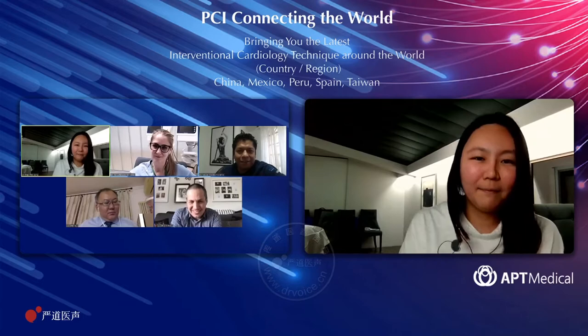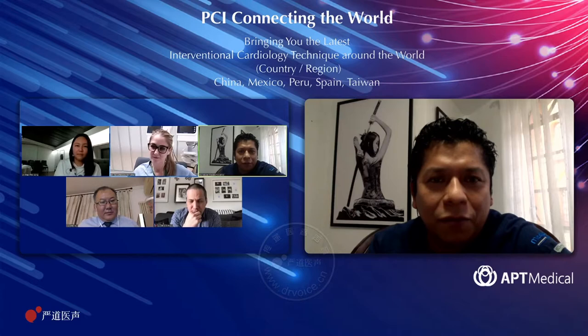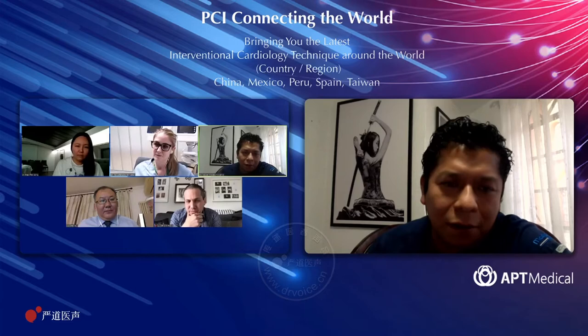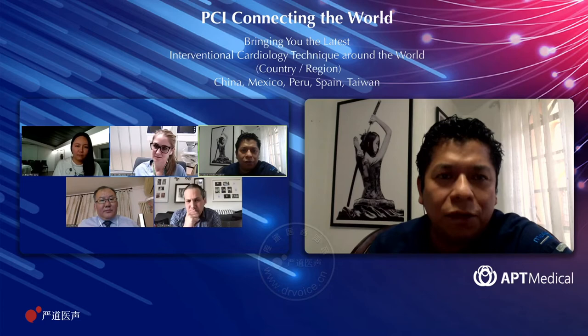Okay, any other question or comment? I think it is a great device again. We have the opportunity to use it in many situations. I think you have some experience with optimizing the proximal stent, when the guide wire is very near to the struts, and of course the buddy wire technique can help. It is very old to try to advance the balloon not too near to the struts and then optimize the proximal stent. But I think it would be a good option to use fewer devices in the coronary artery, and this balloon could help optimize the proximal ostium very well in some cases.